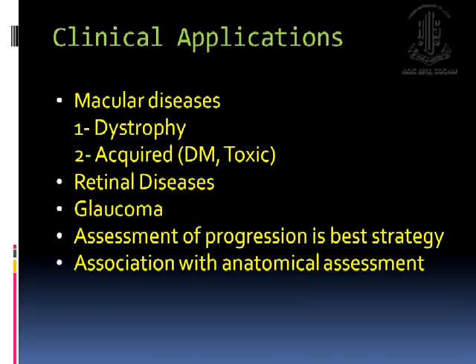Glaucoma is a big thing. It was studied very well in the multifocal ERG and more extensively in the multifocal VEP up till this moment. And of course, your strategy is the assessment of progression: your initial assessment, and then you follow up to see the progression.